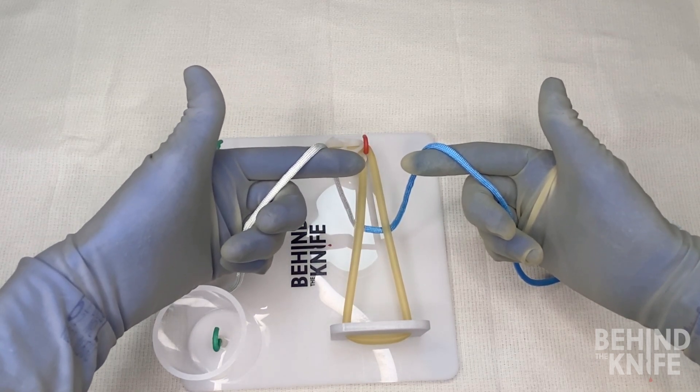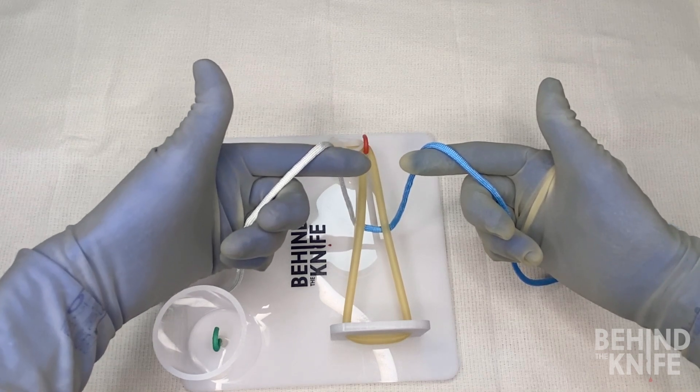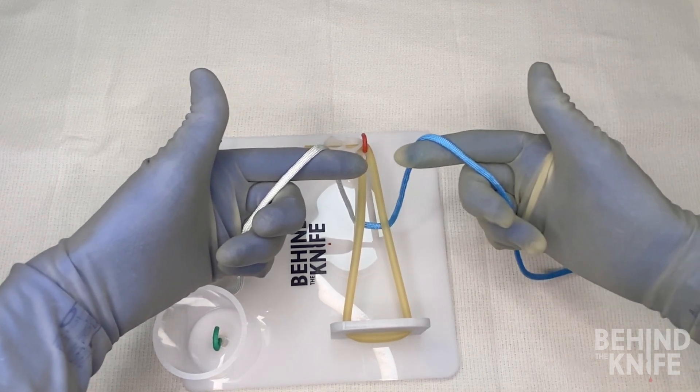Now since this is a left-handed knot, our left hand is going to be our post, and our right hand is going to be the one that's going to start our movement.